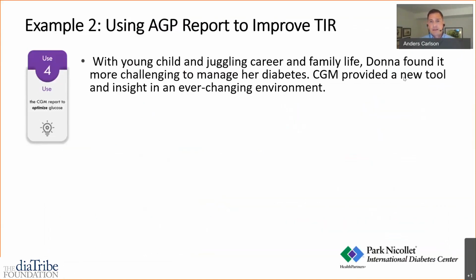And so what we can take away from Donna's case is that evenings are hard for everybody, especially if you're living with diabetes and have a lot of responsibilities at home. And so this has just been a challenge for her, but CGM really gave her a new tool to get insights into her patterns during that time, because remember, it was just chaotic to her, and she was sort of eating to run things high because she didn't really have the data to prove that she needed to or didn't need to.